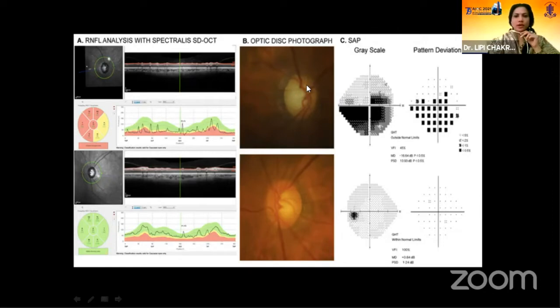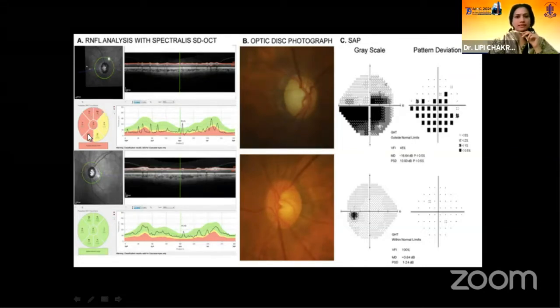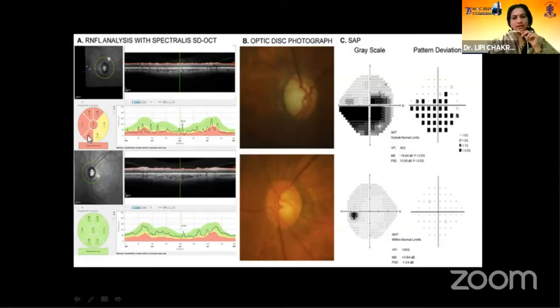Looking at the optic disc photograph — this is the right eye, which has some superior rim thinning. We are getting the characteristic inferior scotoma, and we are finding many red zones. In the superior, because there's superior thinning, superior is red and also temporal and some part of inferior is also in the red zone. The left eye disc looks fairly normal, and we are getting visual fields and the OCT to be normal.